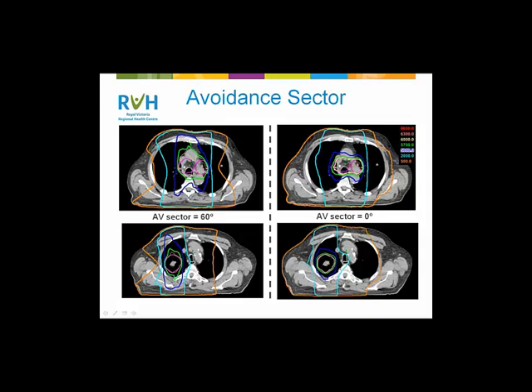When we're just using the big open fields for 18 MV, there are some papers, from Columbia, that looked at the accuracy of the AAA algorithm with heterogeneity correction and found that they were actually quite good. So based on that, we are using these techniques. You've got to be careful which algorithm you're using. Certainly if you were using a beam algorithm, I would steer away from 18 MV. But if you're in AAA, you can have better confidence in the distribution for large fields.